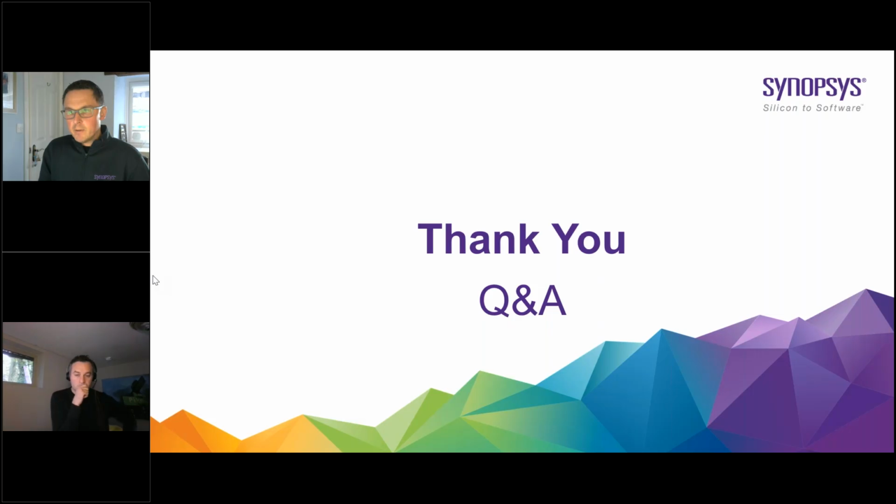I guess in terms of error rate, I'll have a quick go at it first. It depends what you define as an error rate. Usually when we work on the customization, we work up front to define acceptance criteria and what would be acceptable as a clean pass through without any editing. I guess we don't really have errors with the AI. It always produces an output of some sort. Obviously, with the AS ones, it depends on the similarity to the data we trained it on, which hopefully we've tried to make as broad as possible, but maybe not too specific on individual pathology. So try to be as broad as possible.